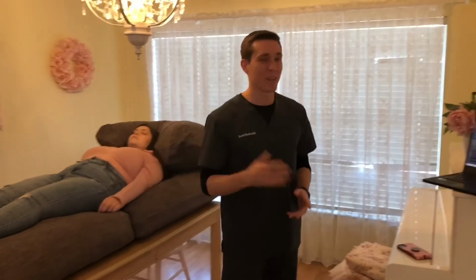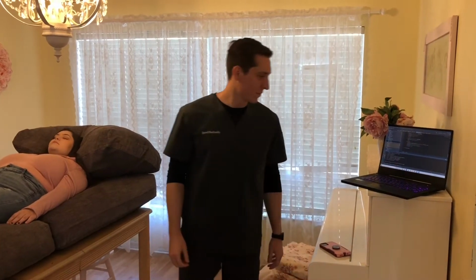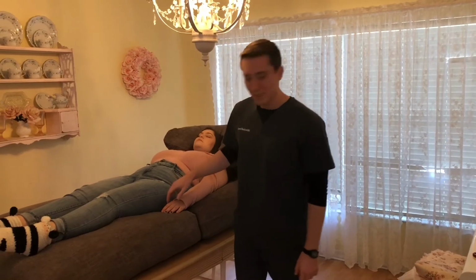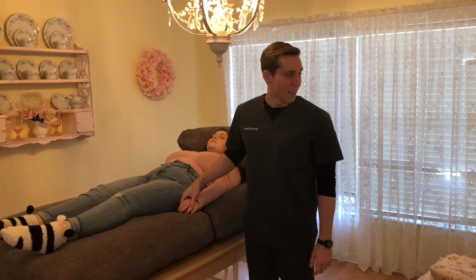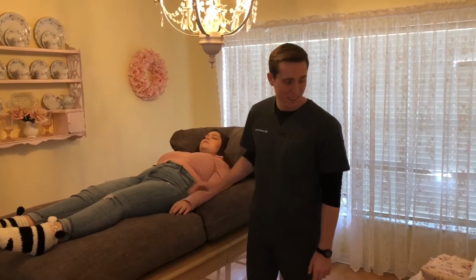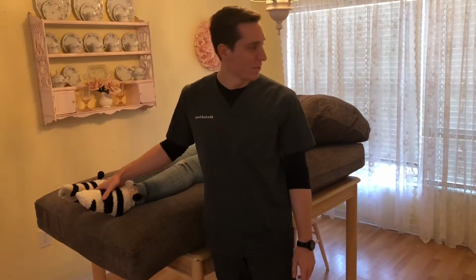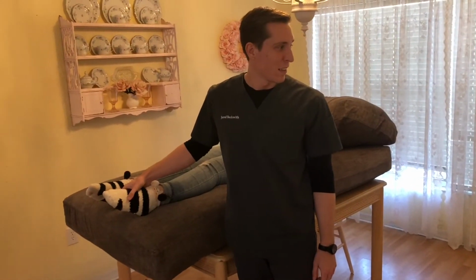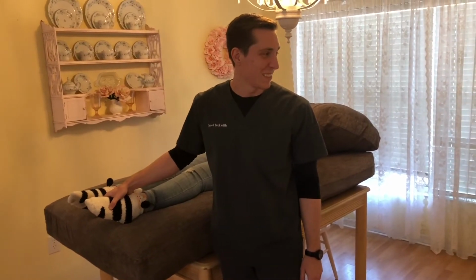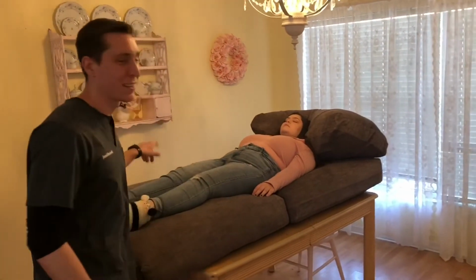Now, here's an example of our program. Ready. Label. Say annotation. Left arm stimulation. Annotation saved. Label. Say annotation. Left foot stimulation. Annotation saved.